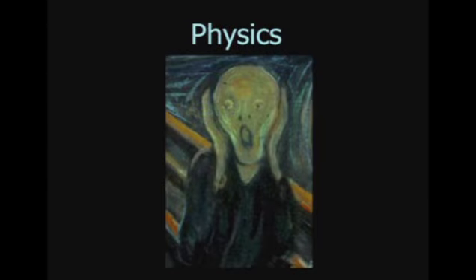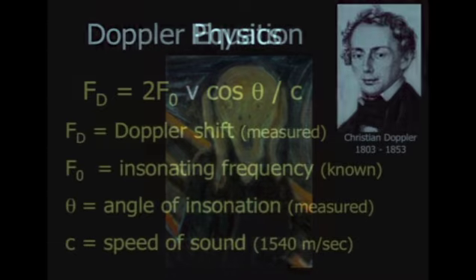Before we get started, you're going to have to understand a little bit about physics, and while that can create some anxiety in people, I think there are some very simple principles that will get you through this and help you to understand the power of Doppler and help you interpret the information you see during your scanning.